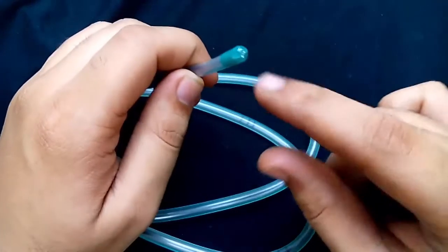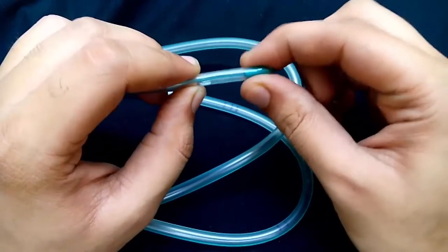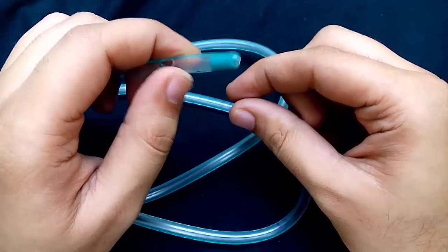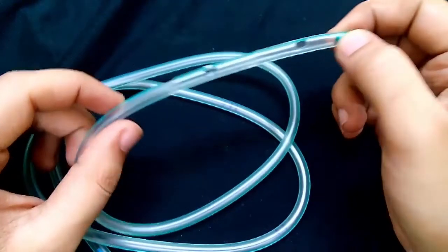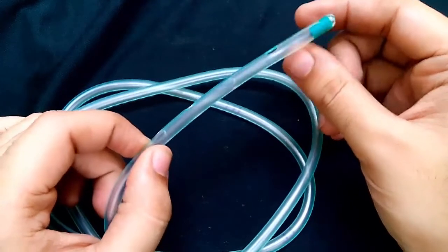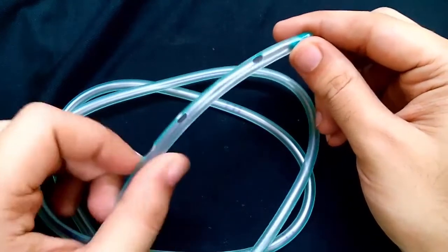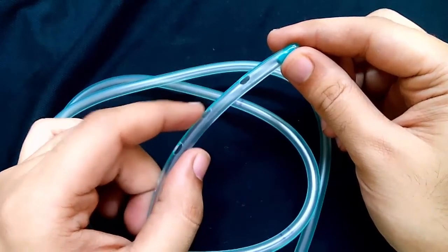The tip of the Riles tube is blunt to avoid trauma. The tip is also radio-opaque so that radiologically we can confirm the position of the tip. At the distal end there are multiple holes or lateral eyes to prevent complete blockage of the tube. These multiple holes are better than a single hole as they don't get torn or kinked easily.